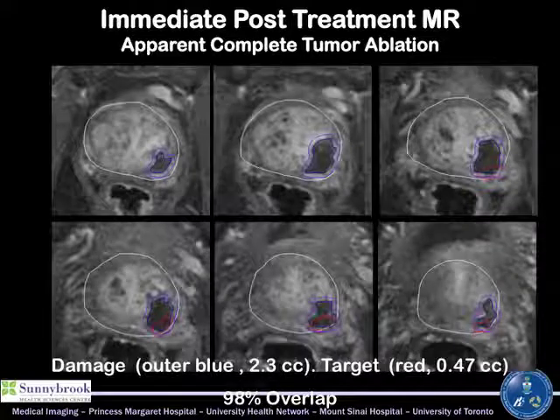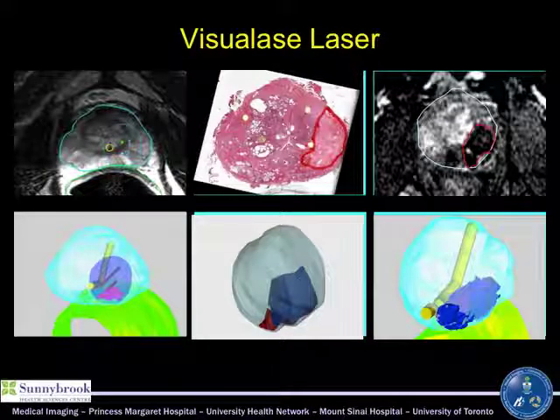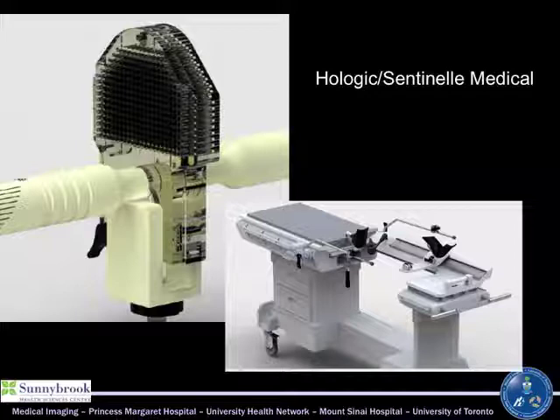And then we do a post-contrast assessment to demonstrate the thermal damage, and then we map this back to, this is the earlier work on doing the pathology mapping. We get nice contiguous burns, and we're able to see what percent overlap we get. There are a variety of systems being prototyped and developed.